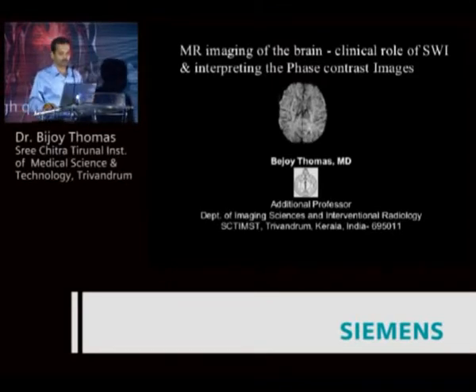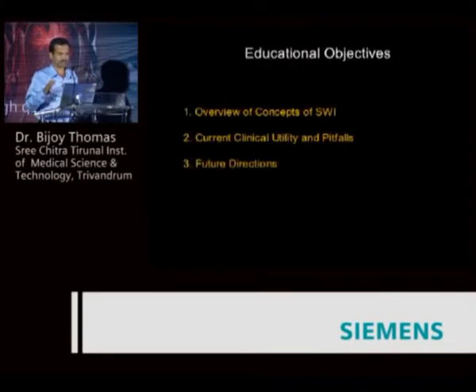So we will go through quickly the physics of SWI. I will not bore you with a lot of physics and overview of the concepts of SWI, because we need to know how it is actually different from conventional gradient echo sequences, and its current clinical utility. It is an evolving sequence. You know that new variants of SWI are coming up, and the future direction.